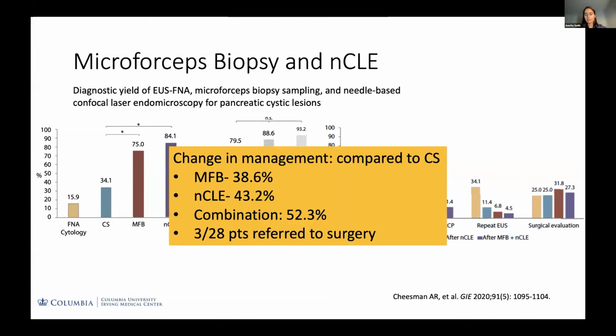And compared to the conventional diagnostic methods of fluid analysis and imaging, the biopsy forceps changed management in 38% of patients, confocal in 43%, and the combination in 52%. And 3 out of 28 patients were referred to surgery who wouldn't otherwise have been considered to need surgery.